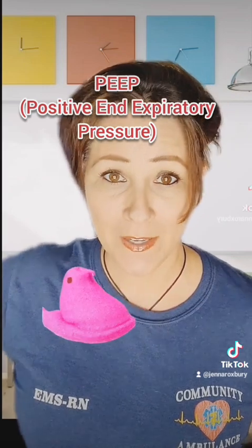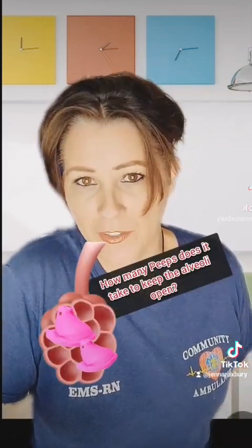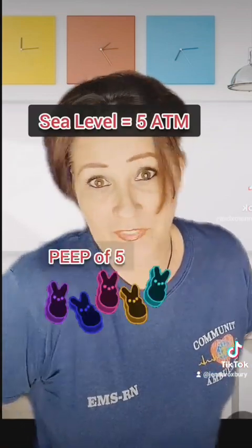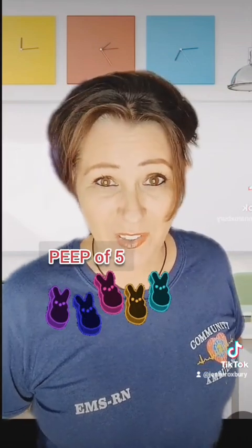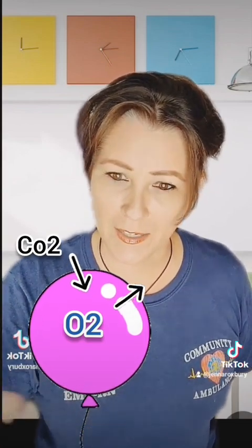Now let's talk about PEEP, positive end expiratory pressure. So how much pressure is required to keep the alveoli open? I'm sitting here sweating my butt off in Vegas, so I'm about 2,000 feet above sea level, so I require 5 of pressure to keep my alveoli open. Fun fact, just think of it like a balloon. Blow it up until you meet resistance, and that's 5 of PEEP. Blow it up past the resistance, and now you're increasing your PEEP. It just gives you more real estate of the alveoli to exchange carbon dioxide and oxygen.